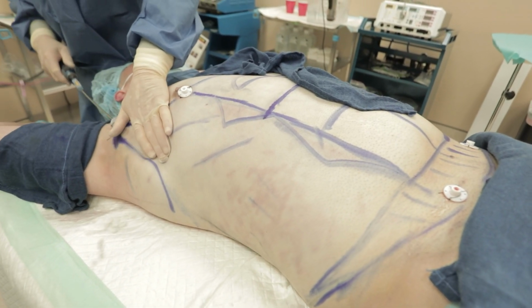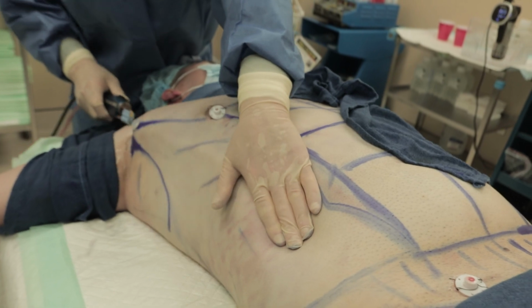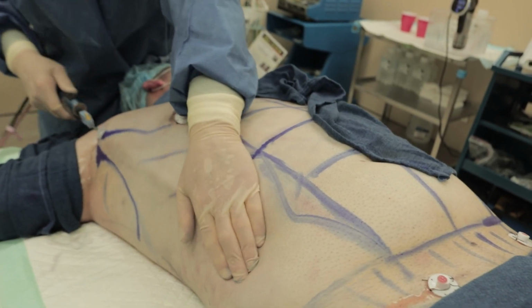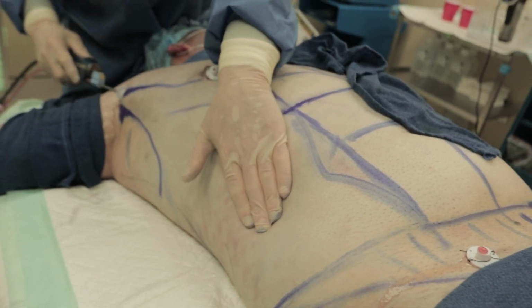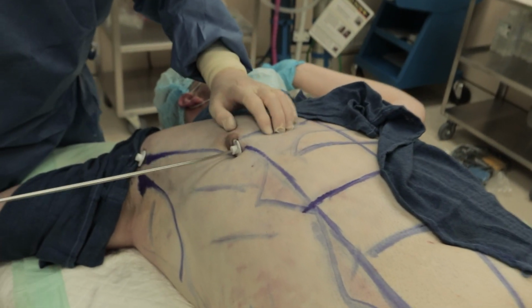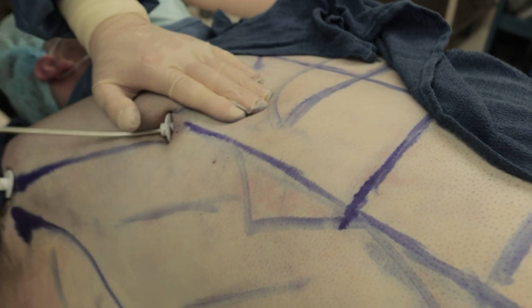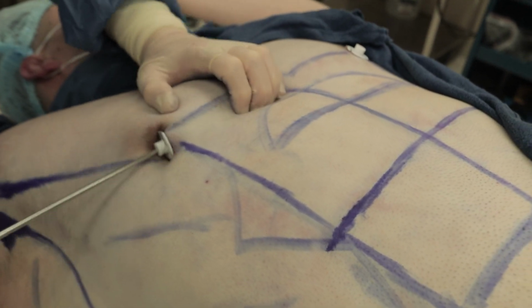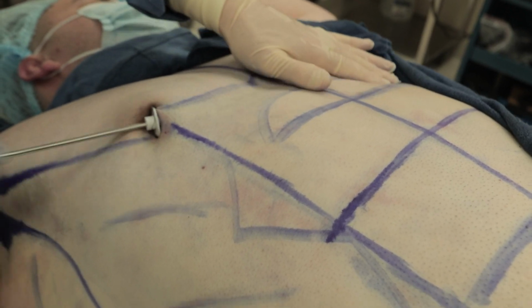Okay? Alright. Good. That's where I'm getting to the mid to lower belly and the sides. And I'll take it up, do from the top down and from the bottom up. You okay? Alright. Good. Nipple incision, and start getting this. So here, I'm etching the inferior aspect of the pec muscle.